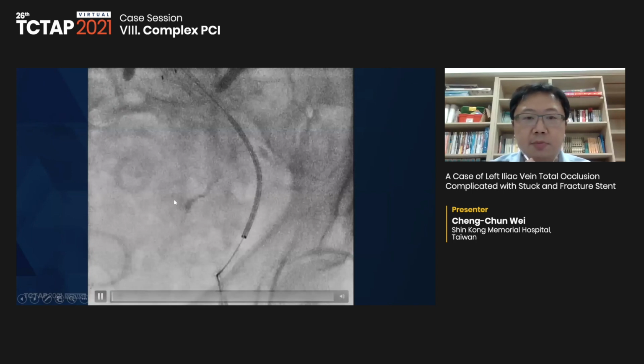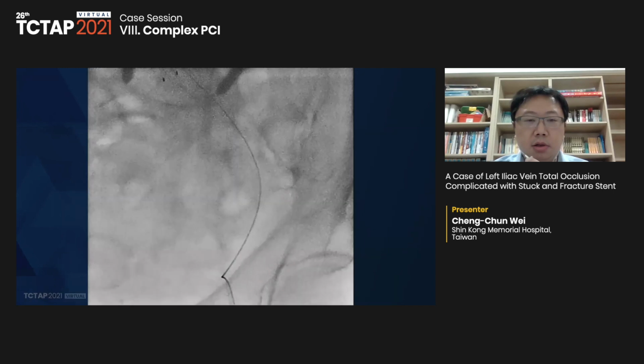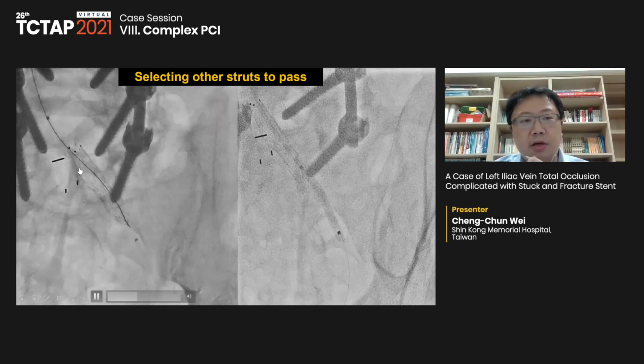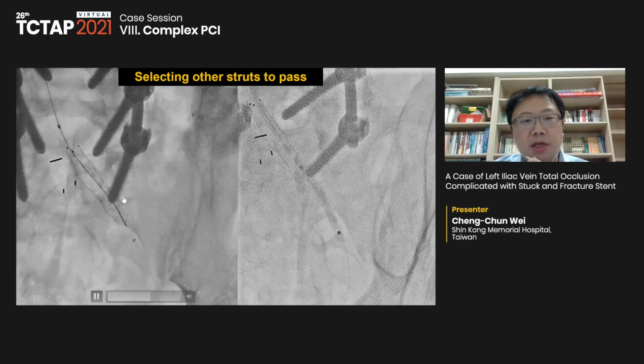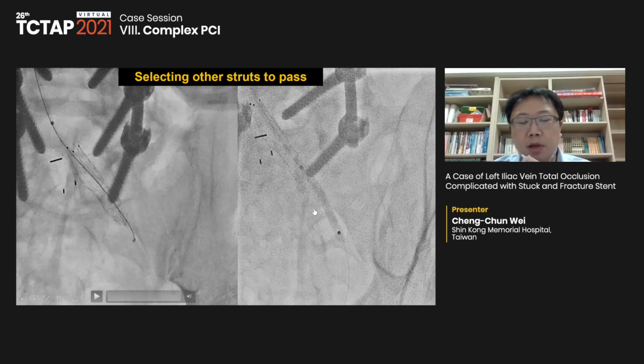Of course, I gave the patient some sedation and analgesia first. Yes, I removed the residual stent like this. After I retracted the stent, the struts over there were completely destroyed and the balloon could not cross anymore. So I used another stiff wire to cross the strut over here and successfully externalized it from this catheter. After I pulled through this wire, the backup was quite strong and I successfully crossed the balloon like this and did balloon angioplasty.